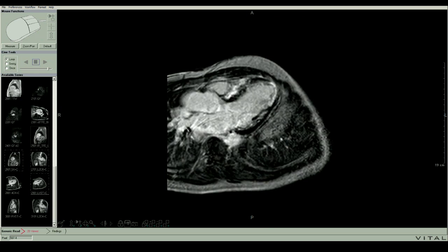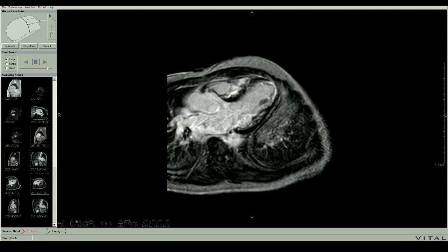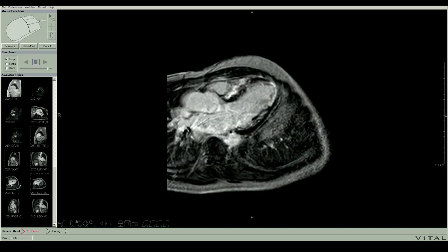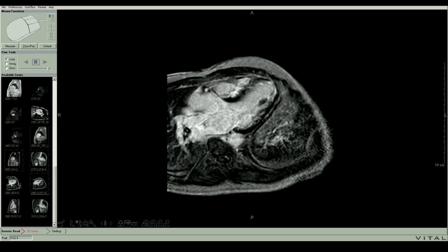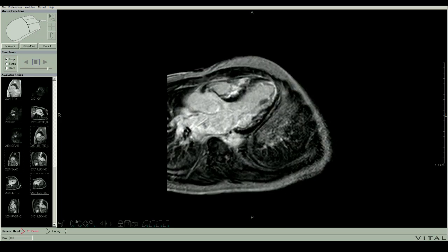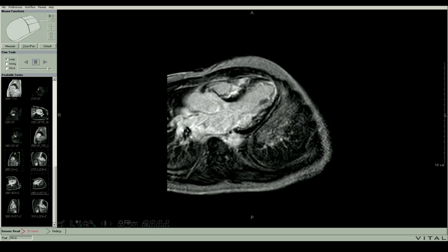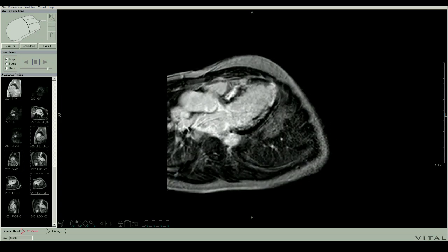And now we've got, here's endocardial late gadolinium enhancement. Sometimes you see blood pool in here, which is an artifact. That's not blood pool. That's endocardium. So we got endocardial. Over here, that's endocardial. It's on the right side, endocardial, subendocardial. And then we've got a big hunk of the septum.